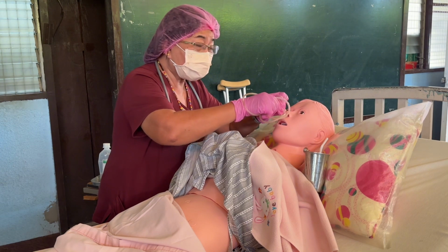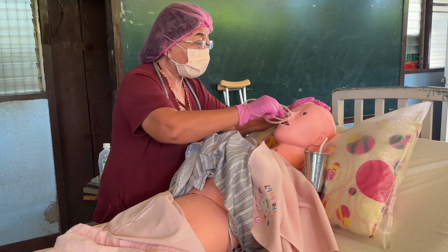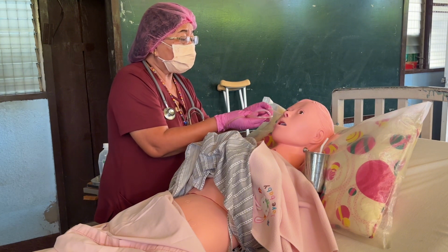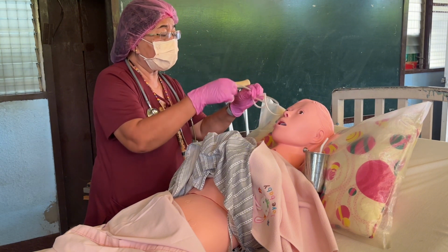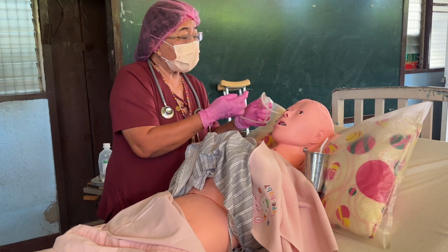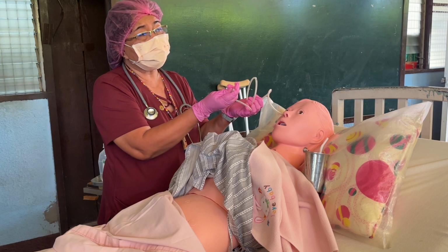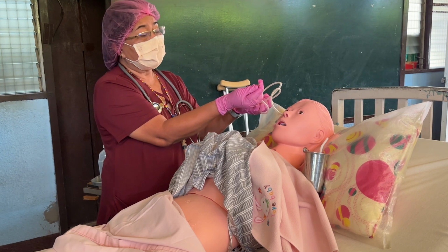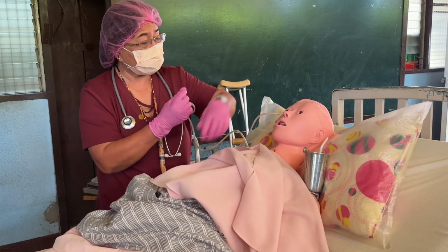So presuming that we've already reached 2 inches below the xiphoid process, right? The length. And then you temporarily fasten. And then you kink, class. Kink. You now determine that the tube is in the stomach because there are gastric juices or gastric contents that come out here. So you better kink it, to avoid mess. Okay, cover the patient.